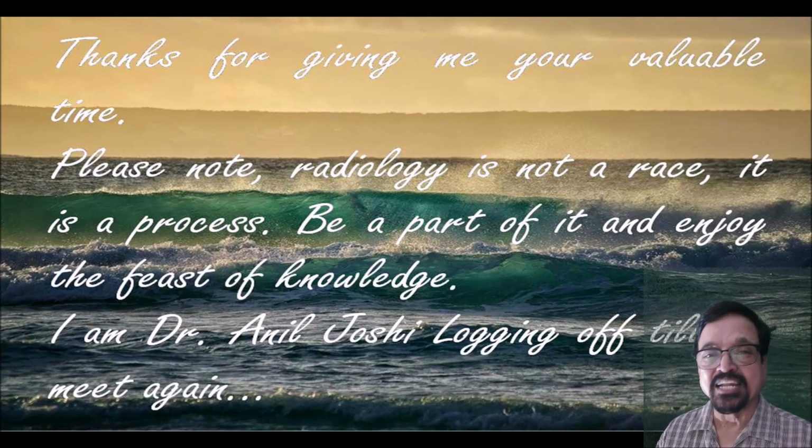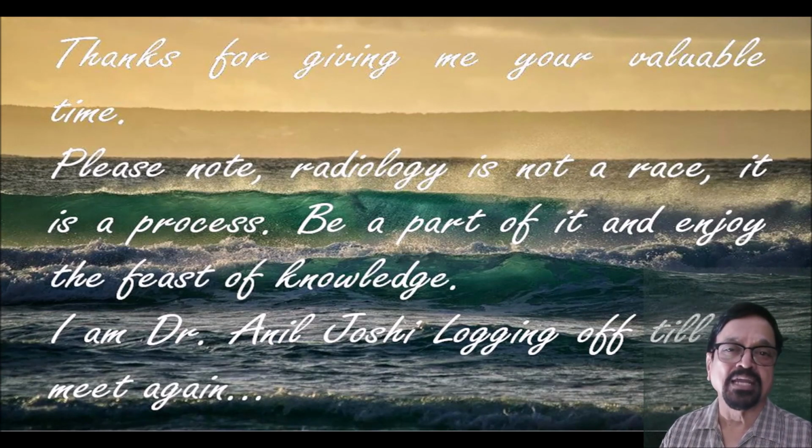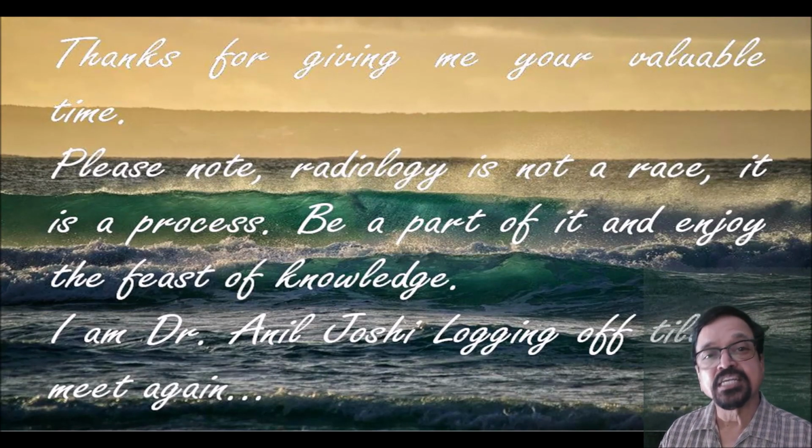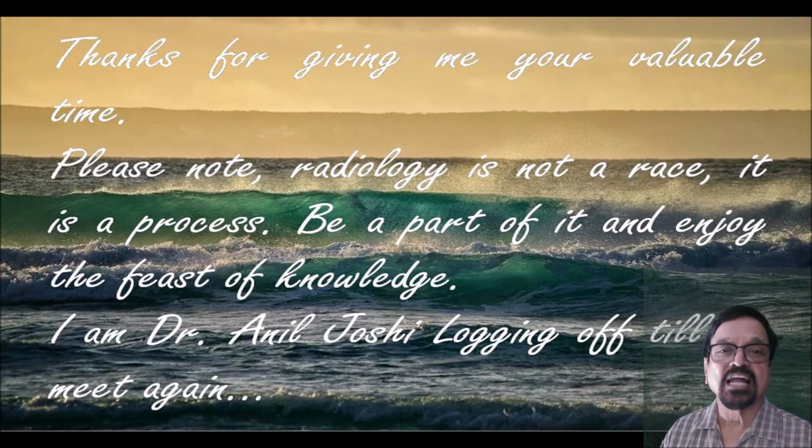That we have studied. We have seen also certain artifacts. We have seen also how to check a safe light. A safe light has to be safe. We have also seen that even in a darkroom, the person who is working in the dark needs to be ventilated properly. He needs to be considered as a human being, and his working condition has to be proper. So there has to be proper air conditioning, proper ventilation, the proper temperature. We have seen manual processing, automatic processing. Now with all these things, the historical aspect of darkroom we are completing.